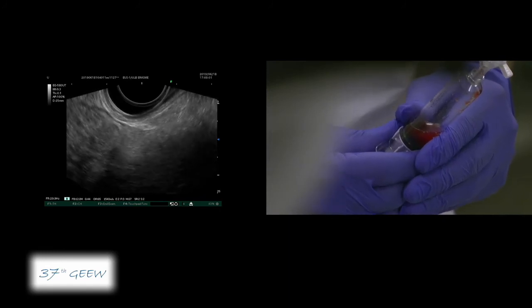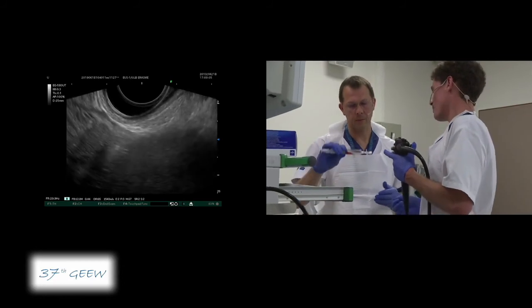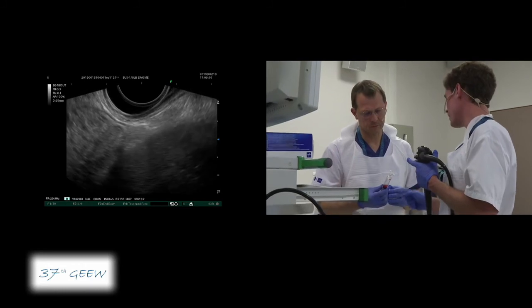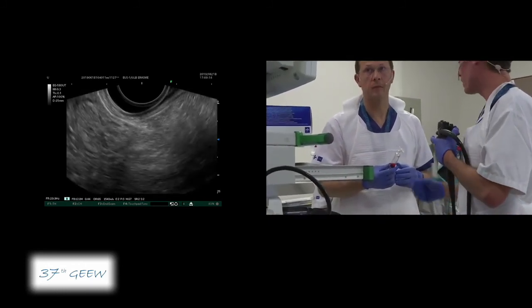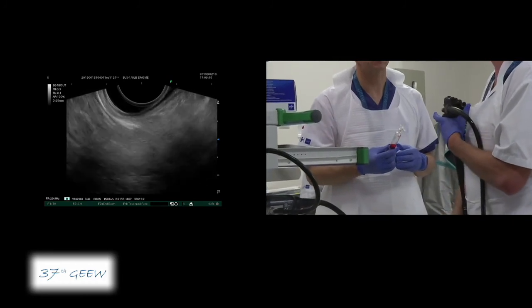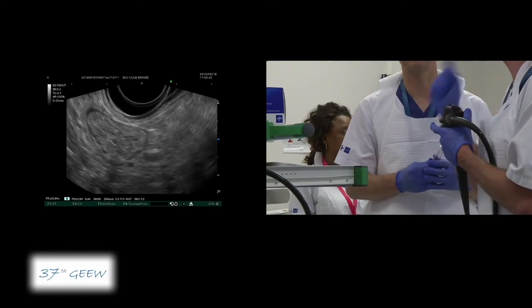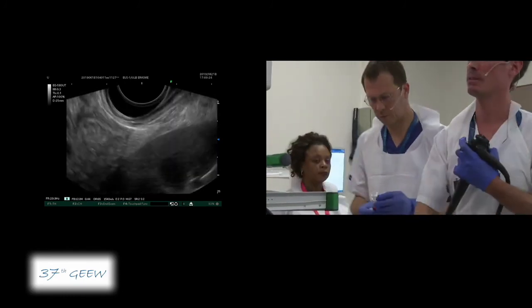Yeah, for sure. So mucinous cyst is unlikely, no? In consideration of this fluid. Based on this, for the moment, you see it's moving like nothing happened, and there is a slight amount of blood. And it's infrequent that you have this kind of blood in a mucinous cyst. It's more likely in neuroendocrine tumors or maybe serous cystadenoma. Okay, thank you very much, my friends. Very good demonstration. Thank you.